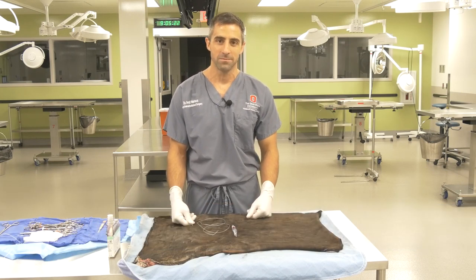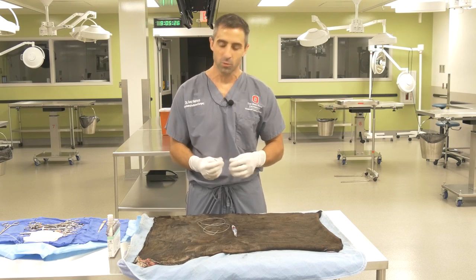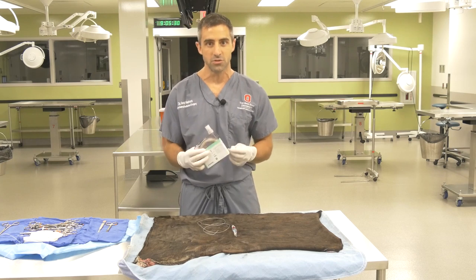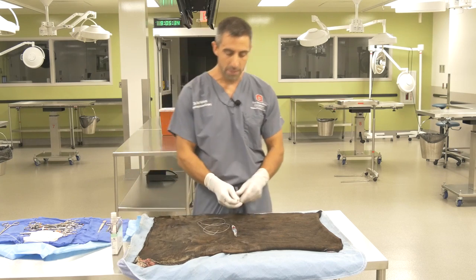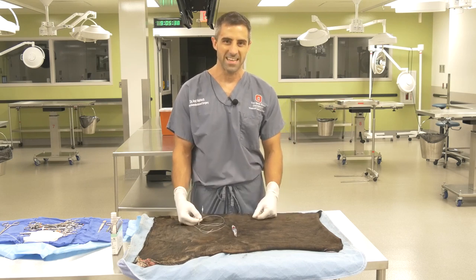Hello. In this video we are going to demonstrate some of the principles of suturing bovine skin. We're going to talk about needles, the suture we typically use for suturing skin in cattle, and principles of how to drive the needle and tie knots in the skin itself.